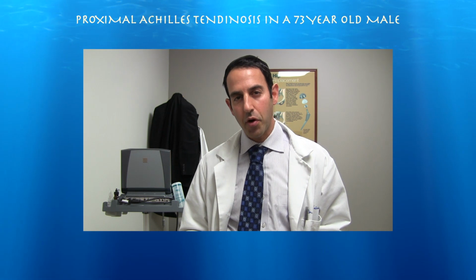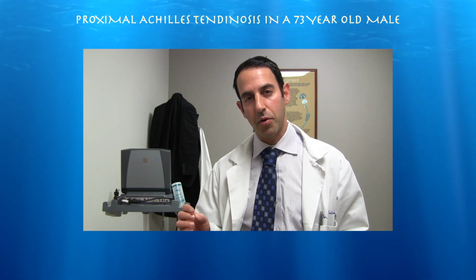Here's a case of a 73-year-old male basically complaining of pain over the Achilles tendon on the left side. There was somewhat of a language barrier making the history somewhat difficult, but physical exam was mostly positive for pain over the Achilles tendon. Here, ultrasound was able to confirm that he did have a tendinotic, boggy, heterogenic type Achilles tendon, which was confirming our clinical suspicion.